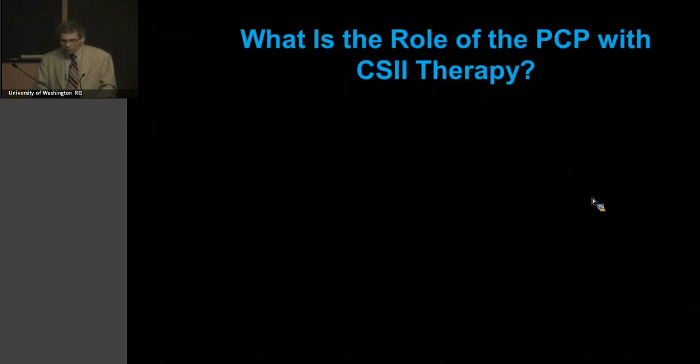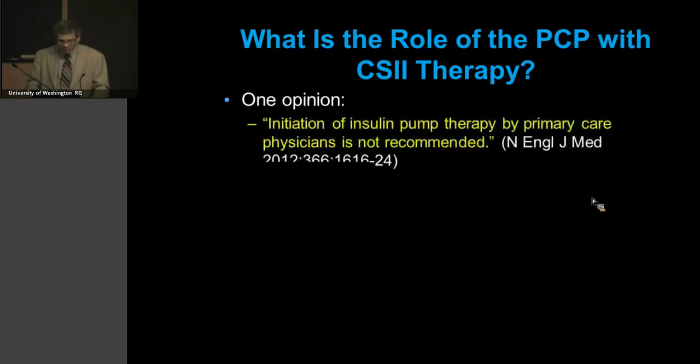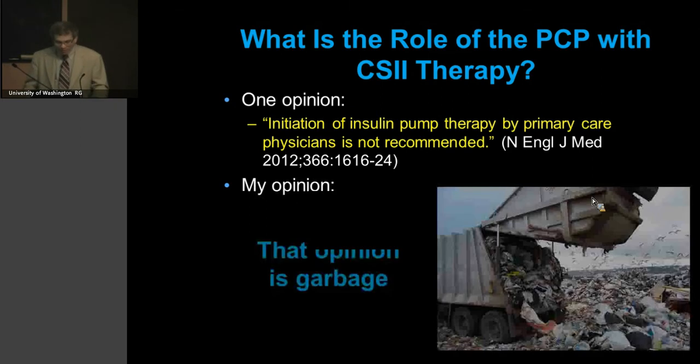What is the role of the primary care physician with insulin pump therapy? And I guess it depends on who you ask. One opinion in a recent review of insulin pump therapy in the New England Journal of Medicine is that initiation of insulin pump therapy by primary care physicians is not recommended. That was one opinion. My opinion on that opinion is that that opinion is garbage.